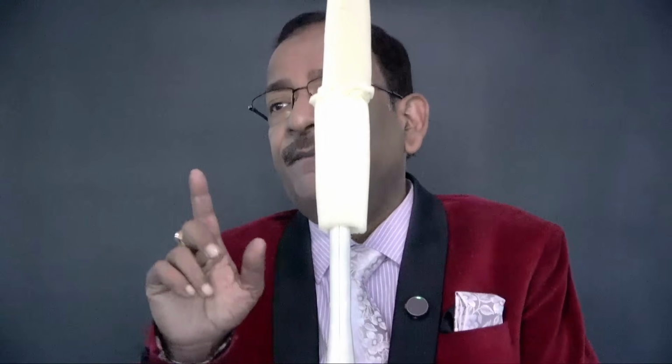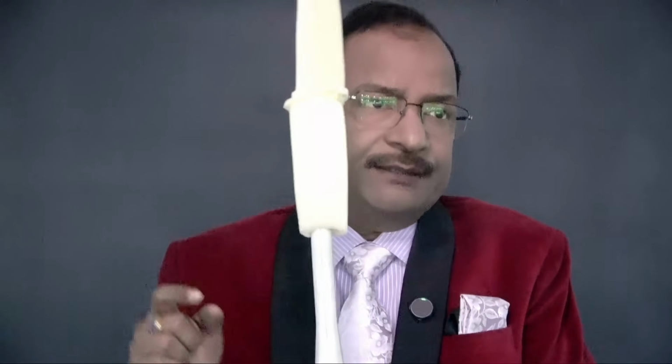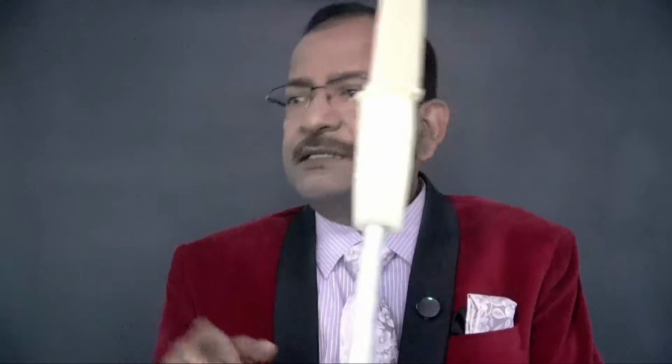And the problem is here that the anvil and gun both are single use. So we cannot use a new cartridge. In a linear stapler also it is disposable, but the gun we don't throw. And we keep on changing the cartridge, like in sleeve gastrectomy or MGB. But here the problem is just one firing, both are useless and you have to buy a new one.